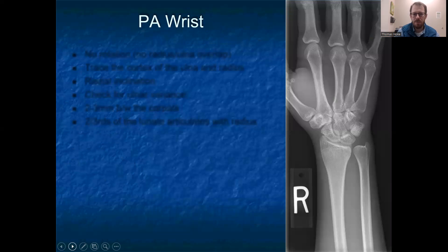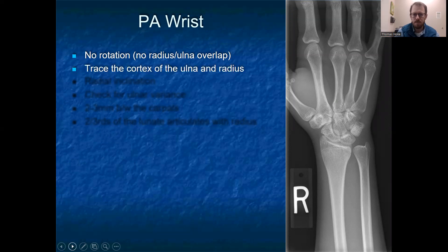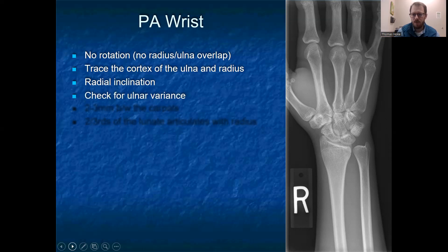Starting with the PA of the wrist: first, make sure there is no rotation so that it's a true PA. Look at the relationship of the radius and the ulna, tracing those cortices and making sure there is no overlap. Then look at the radial inclination — the normal tilt of the radius where the distal radius articular surface is tilted towards the ulnar side. Also check for ulnar variance, which is the relationship of the distal radius to the distal ulna — they are equal in length normally, but asymmetry can predispose to certain clinical issues.